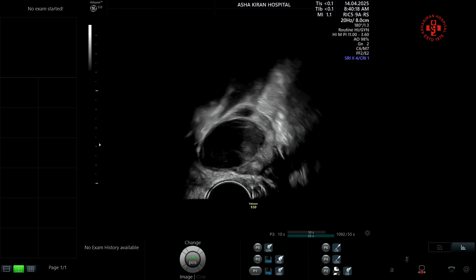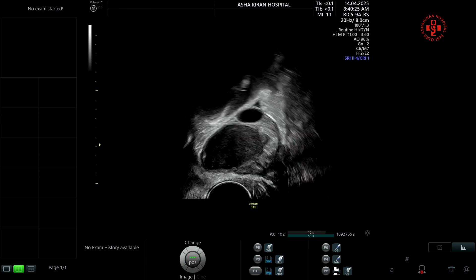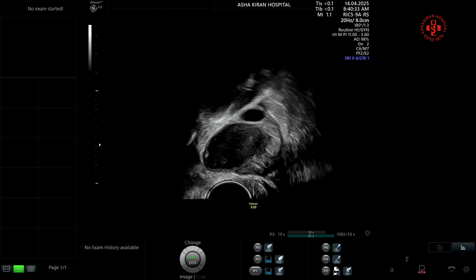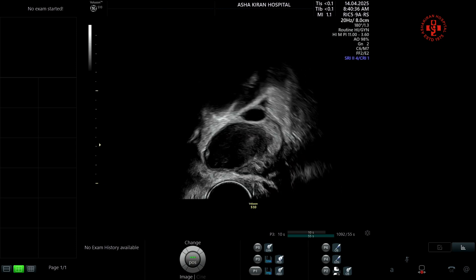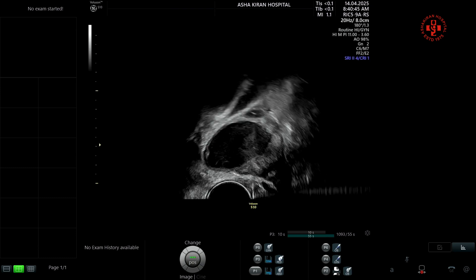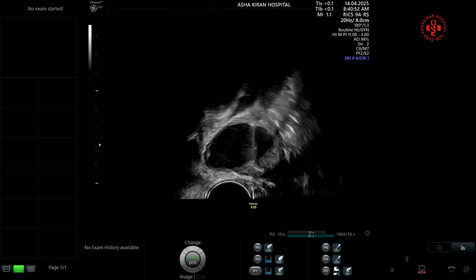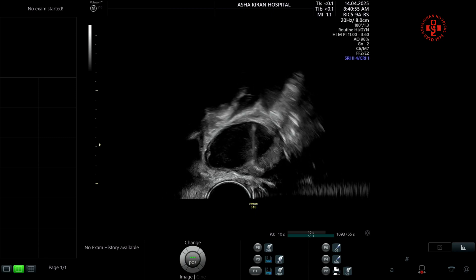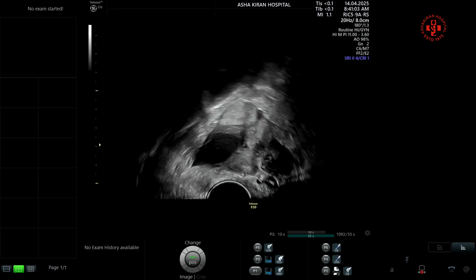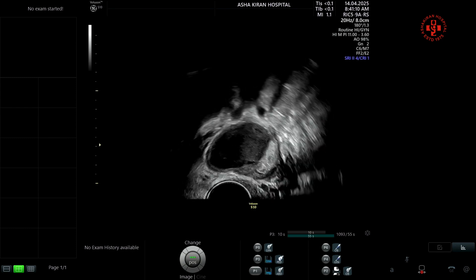Here is our own technique. You can see there is one follicle just above the endometrioma. I pass through the endometrioma without activating the pedal or suction. Once at the wall of the endometrioma, you can see the needle entering the wall — we do a brushing of the needle at the wall before entering the follicular fluid. Only follicular fluid is aspirated. Once the follicle collapses, I release the pedal and perform the same brushing movement at the endometrioma wall while coming out.